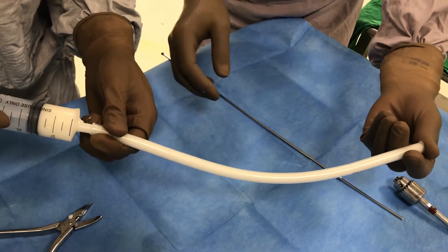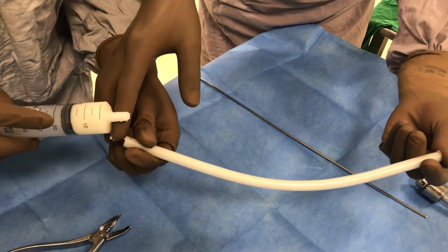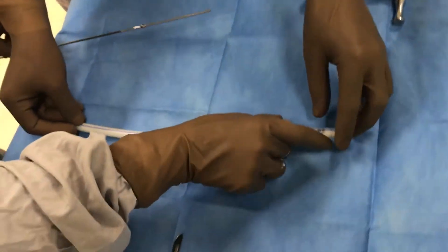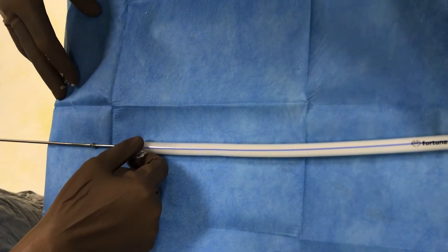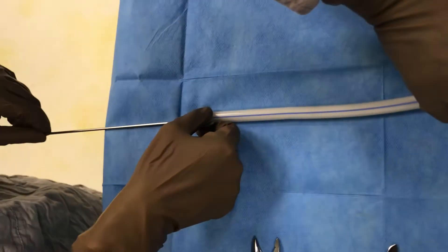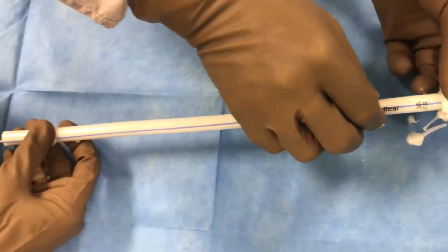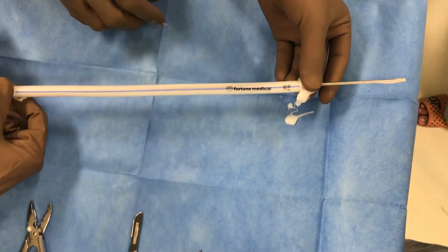Keep inserting to get the adequate length. You can get the required length from the X-rays, from the extracted nail, or measure it manually with a ruler. Now insert the wire into the center of the rod — this will ensure proper structure. Don't worry, some cement will come out; that does happen as the wire is being inserted. Keep the tip at the corner so it supports the body of the cement.